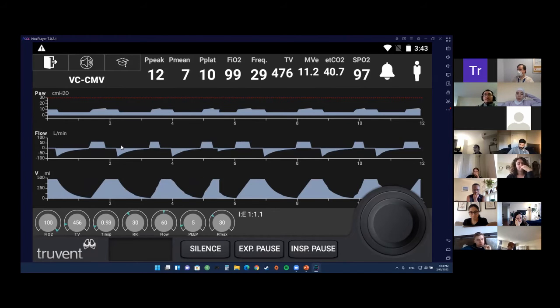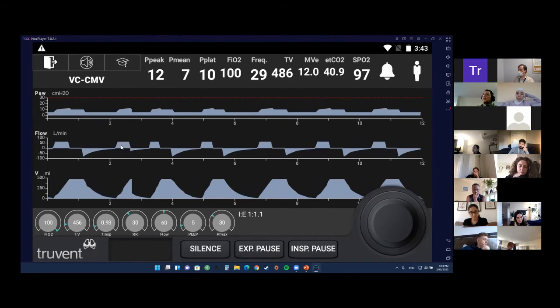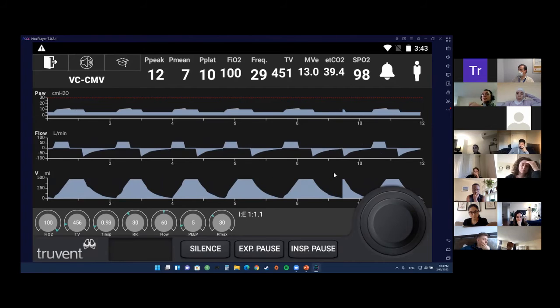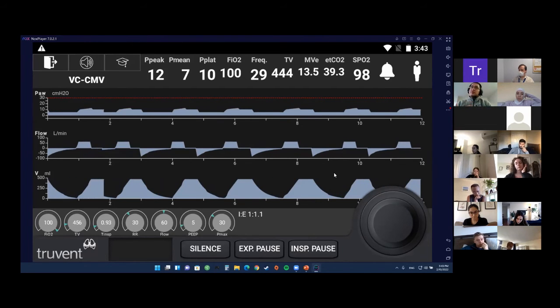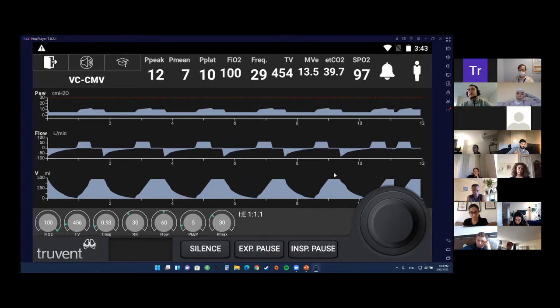If you get a patient in the ED with DKA and a pH of 7.15, their breathing is going to look like this. They're going to be breathing at high volumes and very fast. So don't be afraid to simulate that on the ventilator. That being said, you mentioned something very important, which is checking a new gas. If you made changes to the ventilator, increasing the tidal volume or the rate, these are going to change the CO2. So you have to do a new gas to make sure the CO2 is moving in the right direction and the pH is not getting worse.